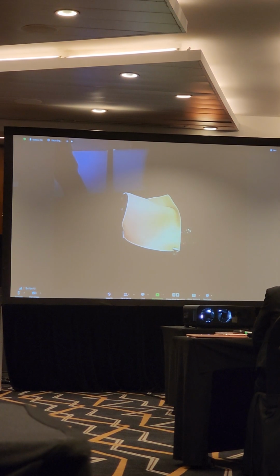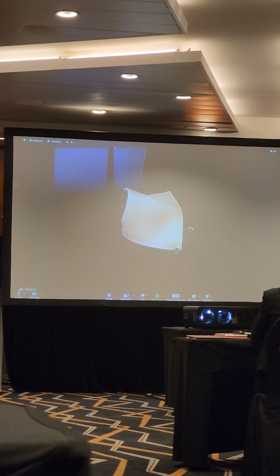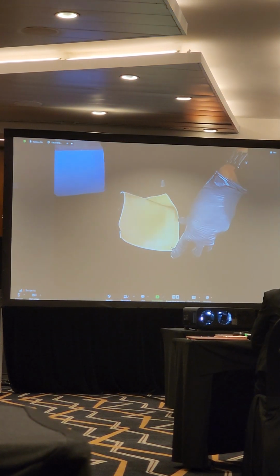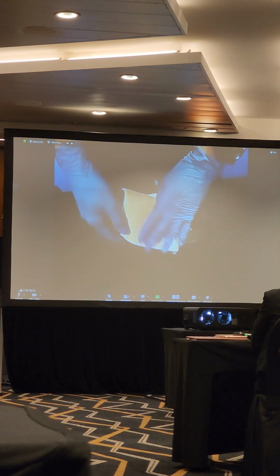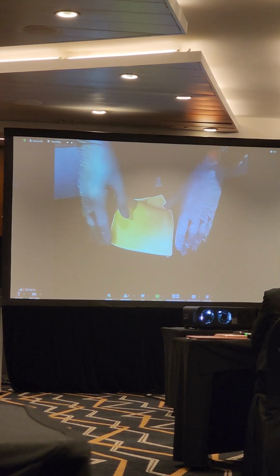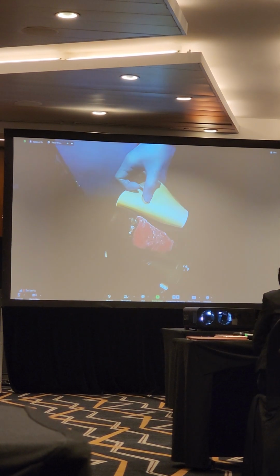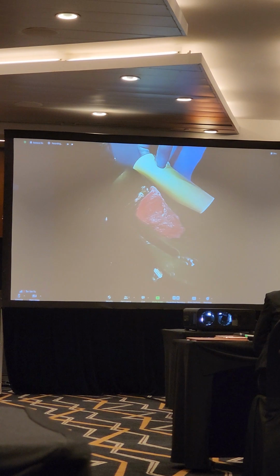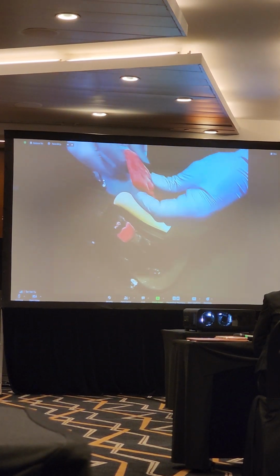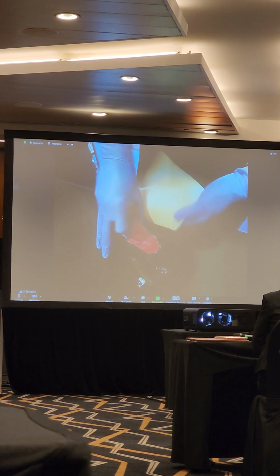Focusing on the models that we have in front of us, small variations can be made to change the difficulty level for various learners. The one that Sean did had a little bit easier landmarking. If we want to make it more challenging for more experienced learners, or for someone who wants to practice with a patient with more subcutaneous tissue, a shorter neck, a more challenging airway situation, what we can do is insert a silicone casted sheet, which is quite cheap and easy to make, over the 3D printed larynx, and then place the skin over that.